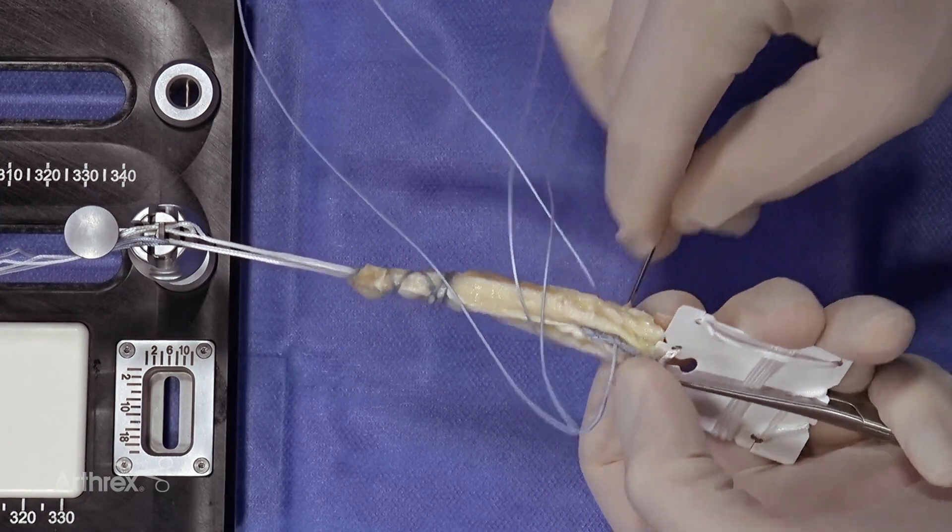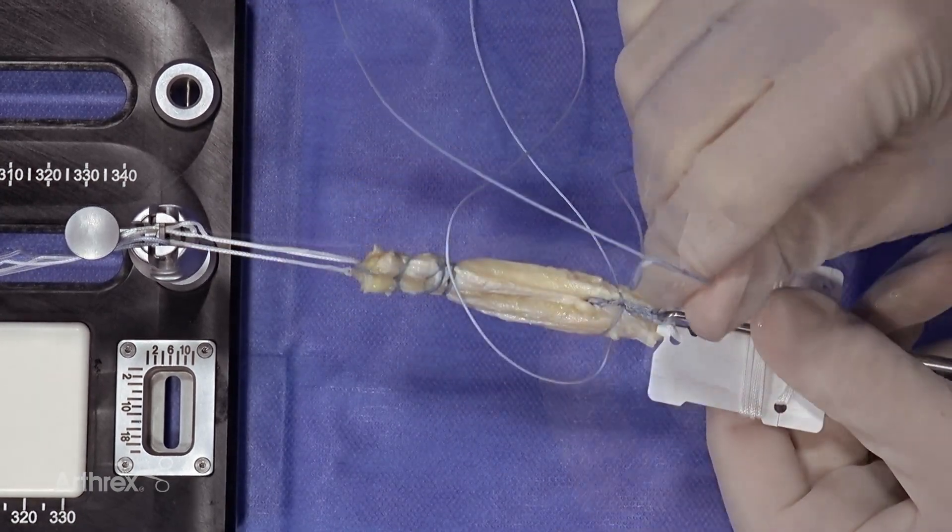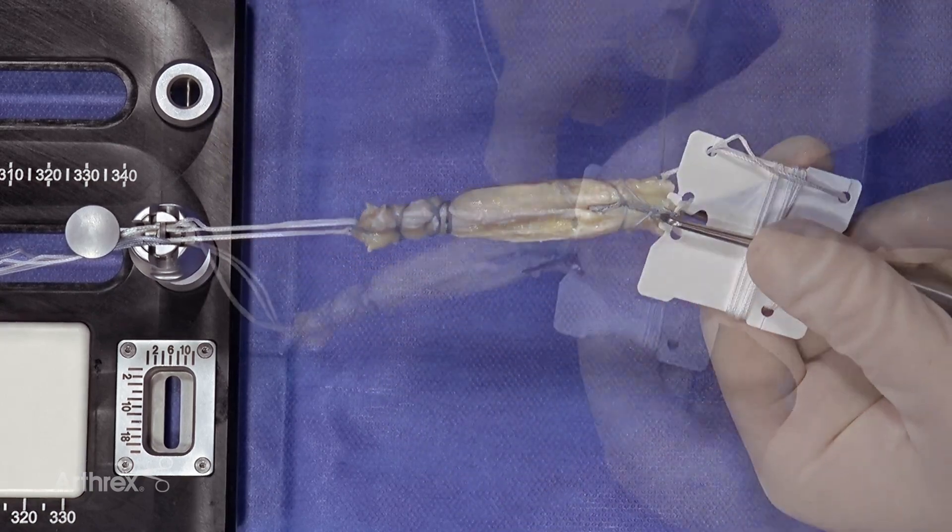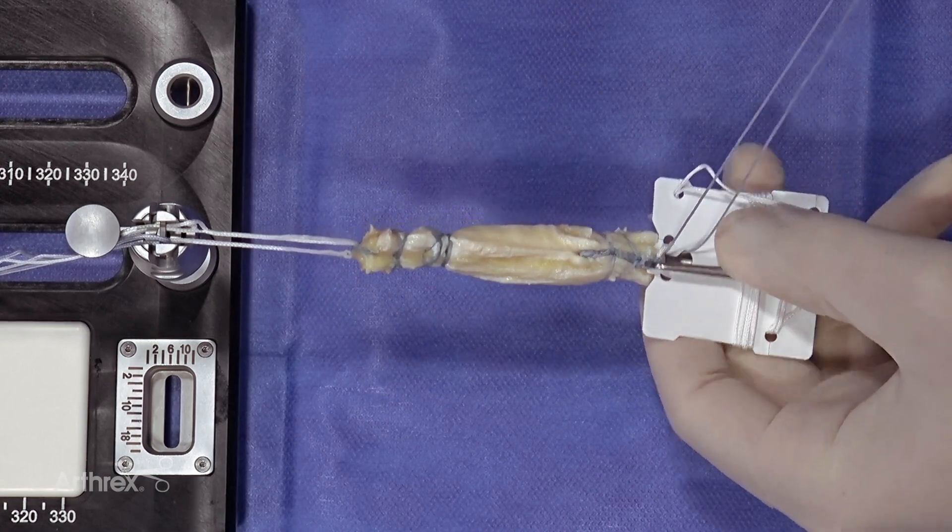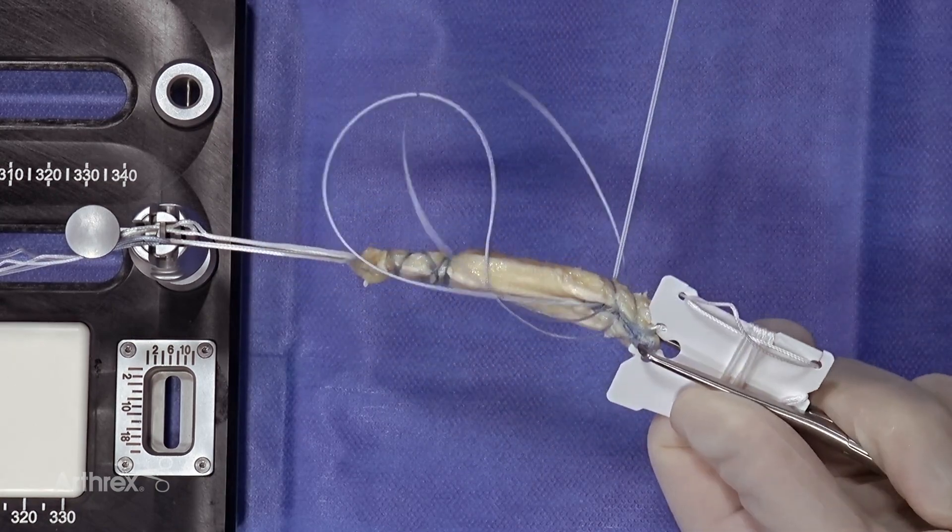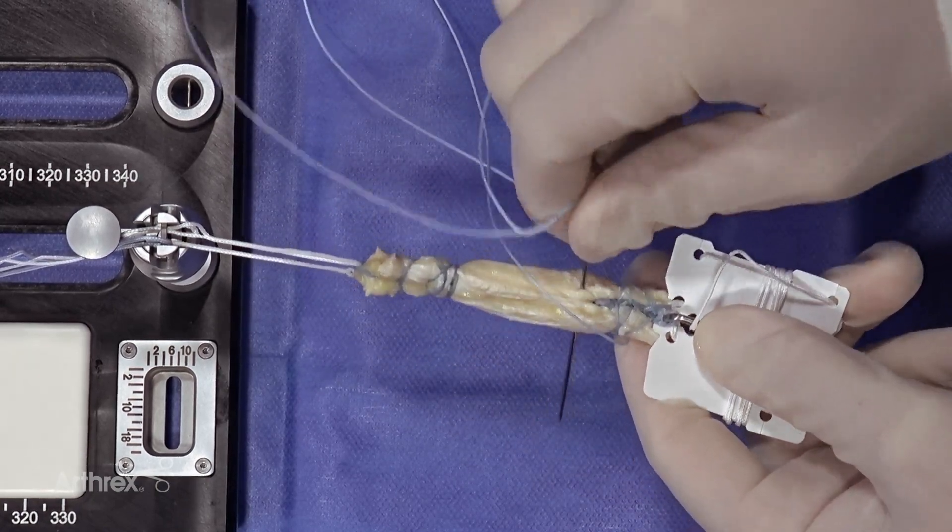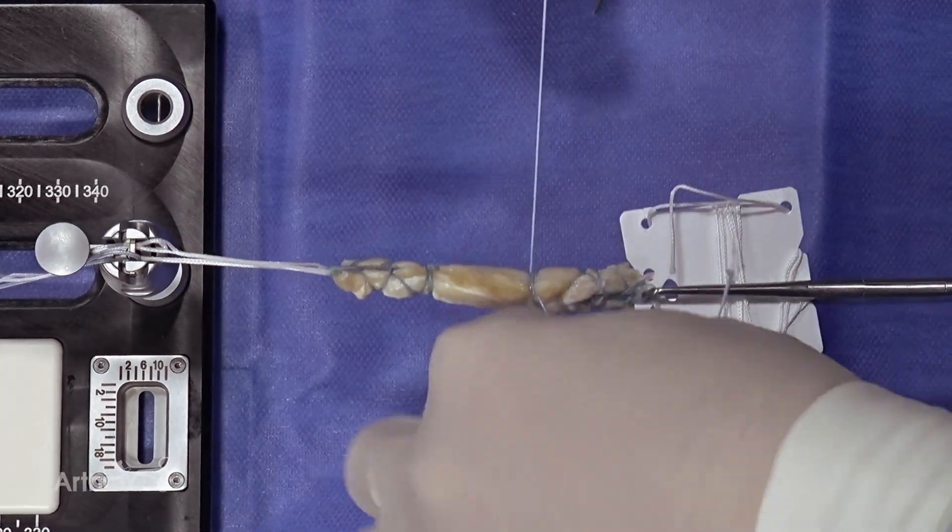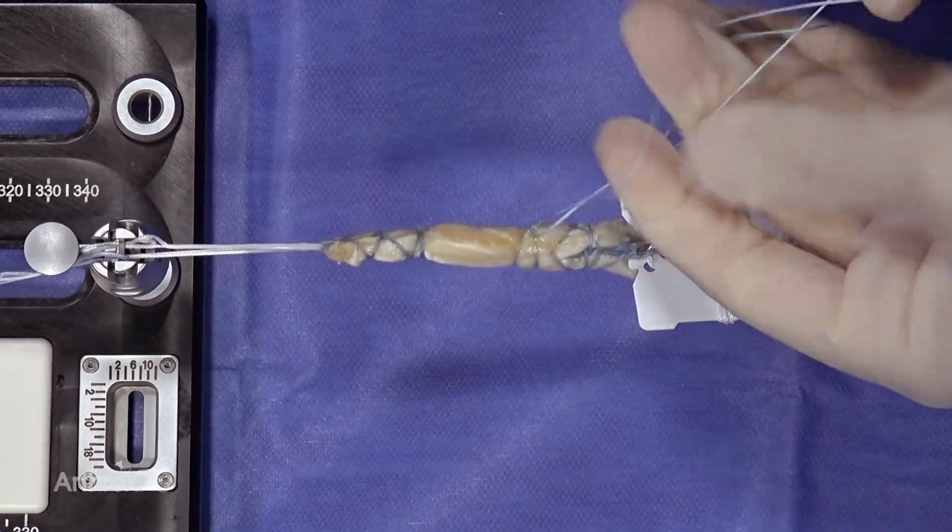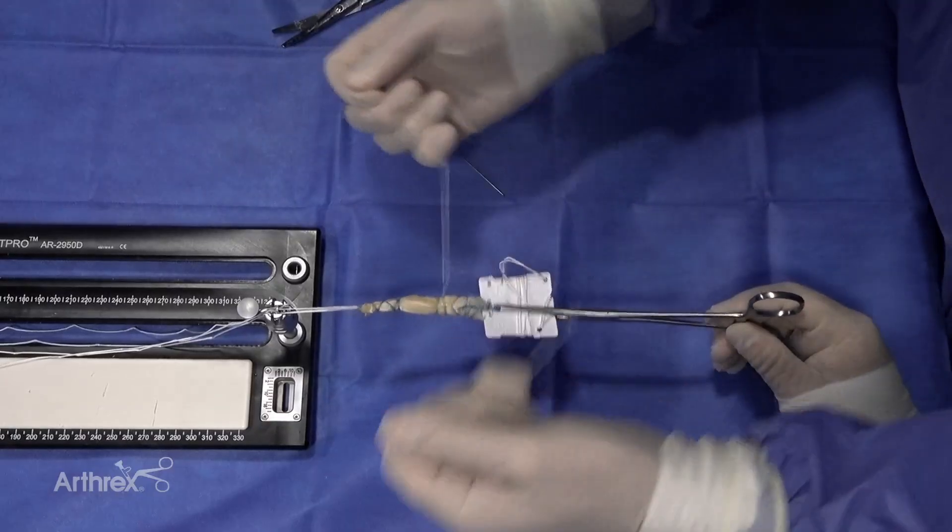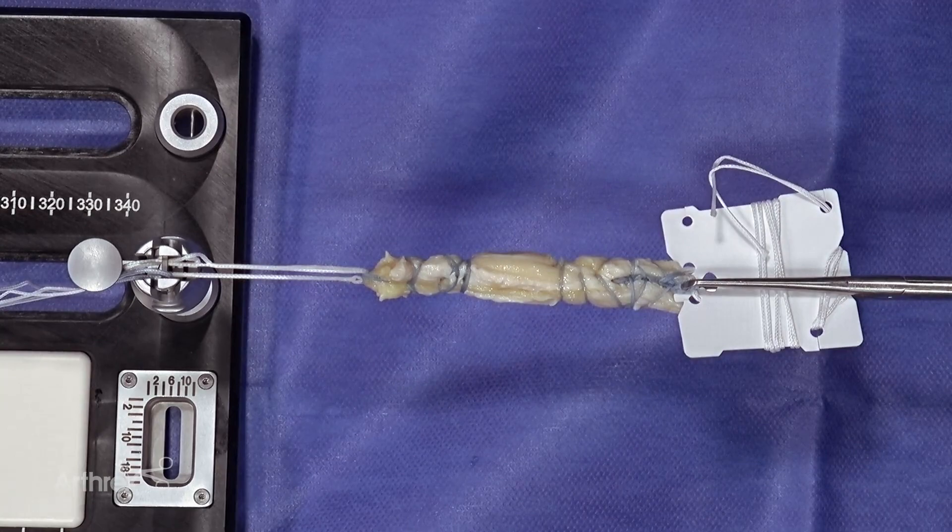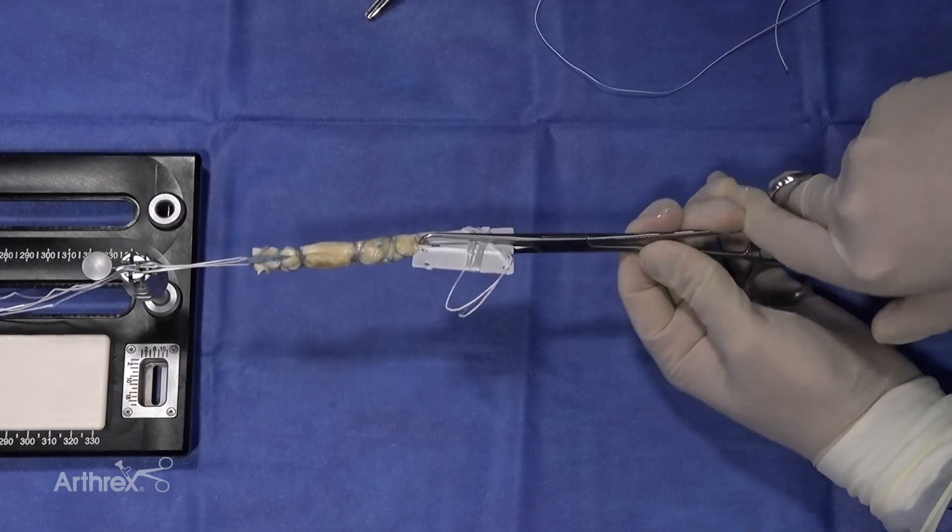We go up about halfway and place a second throw. Notice again how we're pulling it, this is key. We come through, go around, and again if wanted you could stop right here and tie it off. We want to show you the technique during this video so we're throwing multiple sutures. Then again we bury the knot and you're done. You have a completed graft.